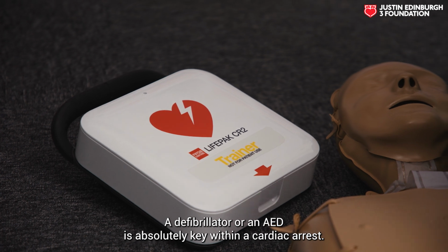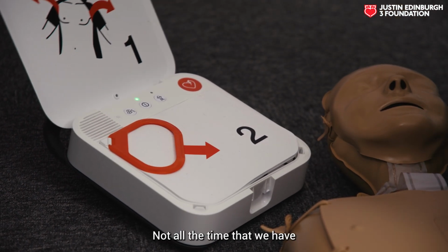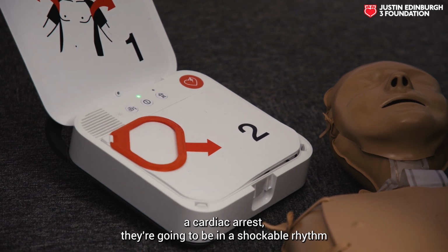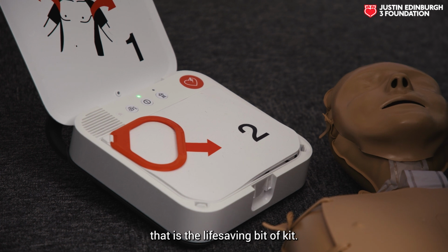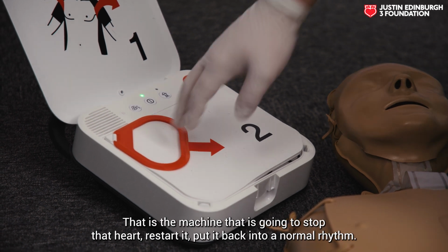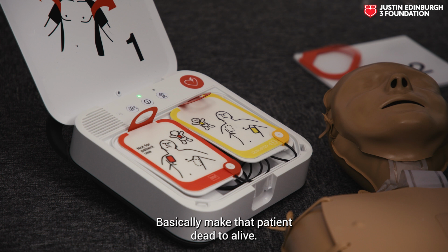A defibrillator or an AED is absolutely key within a cardiac arrest. Not all the time that we have a cardiac arrest are they going to be in a shockable rhythm, but if they are in a shockable rhythm, that is the life-saving bit of kit. That is a machine that is going to stop that heart, restart it, put it back into a normal rhythm, basically make that patient dead to alive.